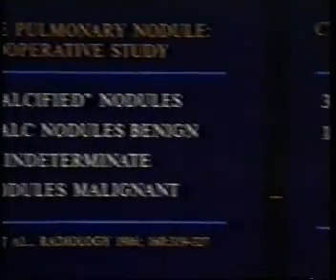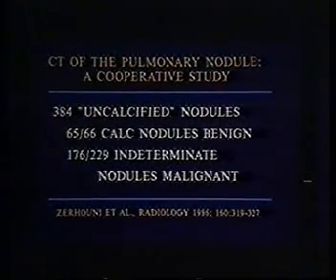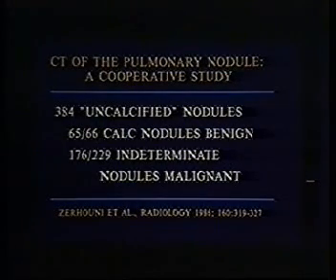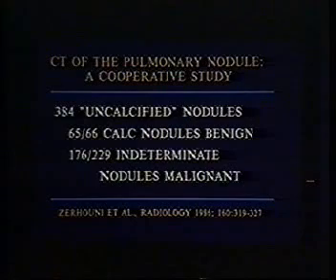Now, how accurate is this phantom, or does this phantom help a lot in the diagnosis of solitary nodules? Well, in a cooperative study that Zerhouni performed and reported in 1986, 384 nodules which were apparently uncalcified on plain films or conventional tomos were studied. 65 of the 66 nodules that were called calcified using the phantom and CT were indeed benign.